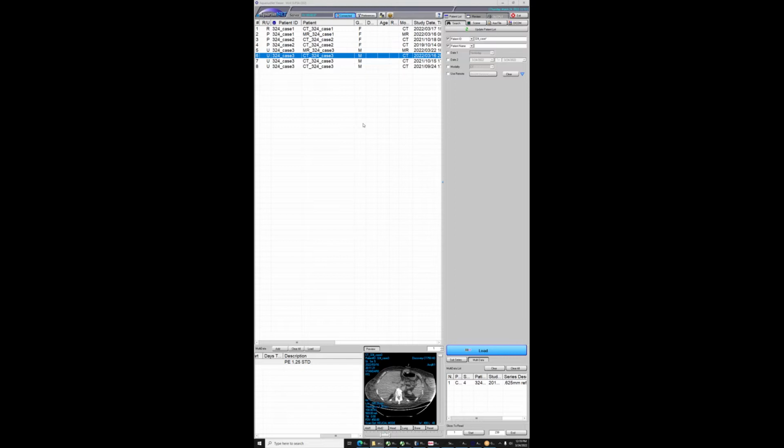Yeah, I agree though. The true acute HP seems different than that too, because I think they're more talking about what used to be subacute with just centrilobular ground glass nodules being the non-fibrotic form. Exactly. But it kind of leaves out the acute form, which is super rare anyway, so it's probably not a big deal. It's just super rare.